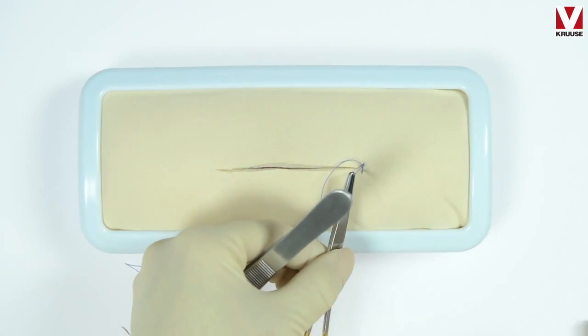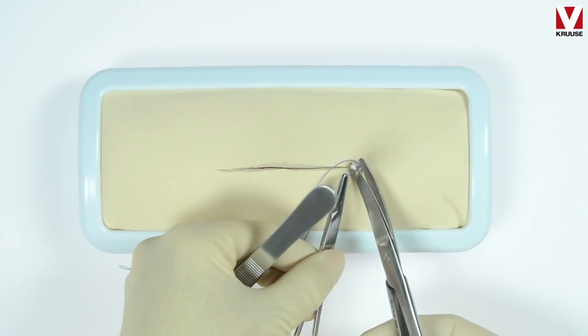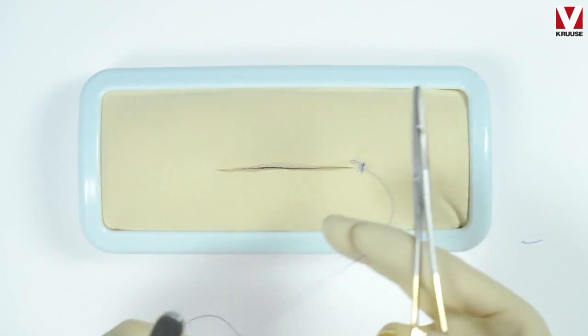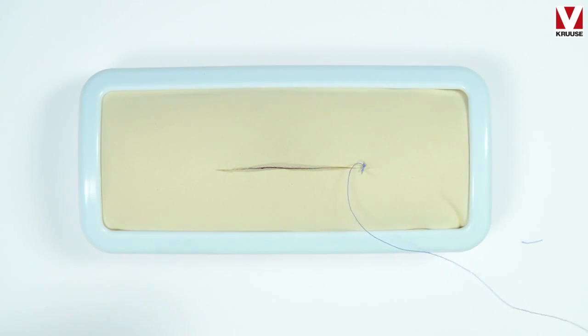You will cut the suture end. Try not to leave too much suture material in the animal.